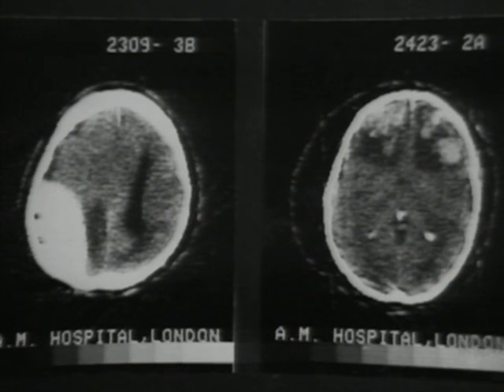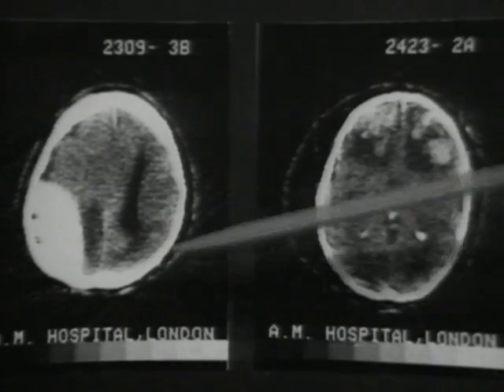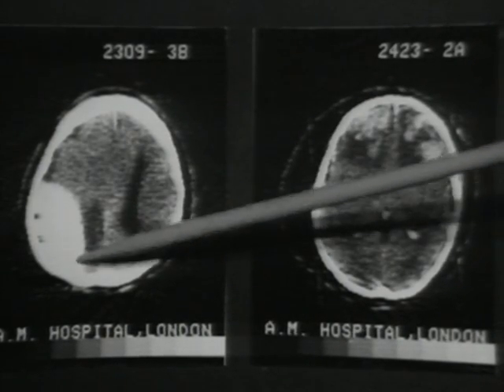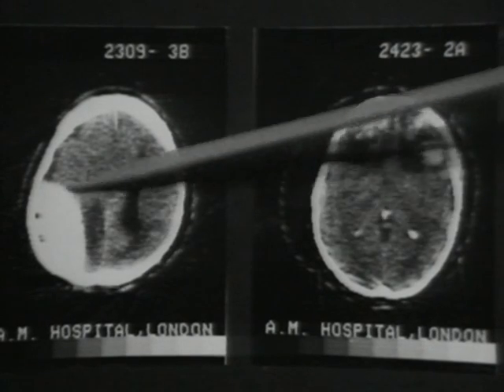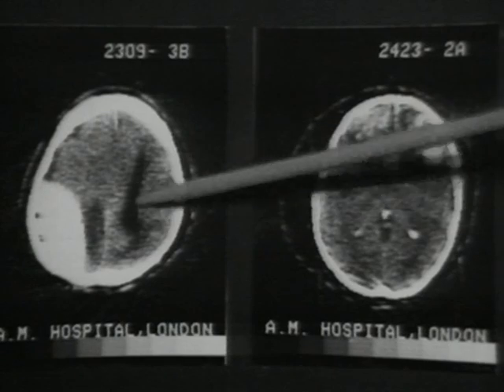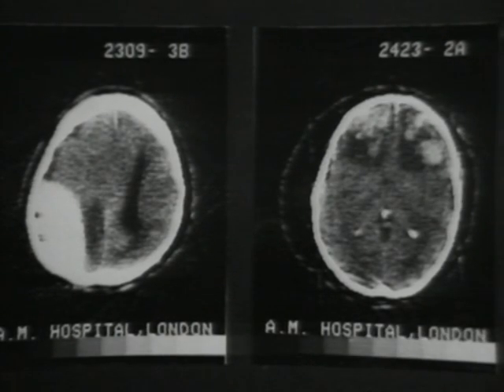Now, here we have a patient with an obvious extradural hematoma in the left posterior parietal area. You can see its characteristically inwardly convex edge, and it shows the very high density of clotted blood. The lateral ventricle on the contralateral side is seen to be displaced away from the midline.